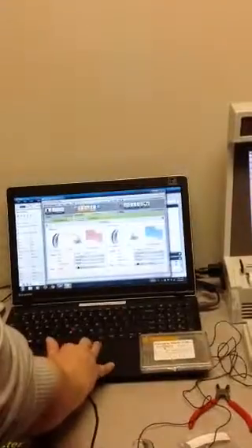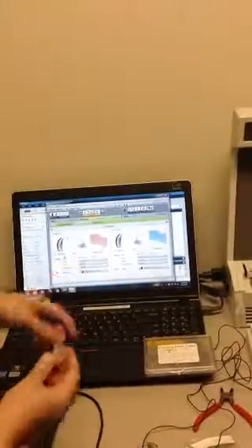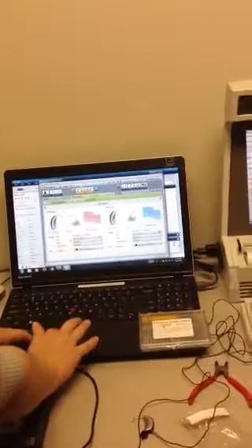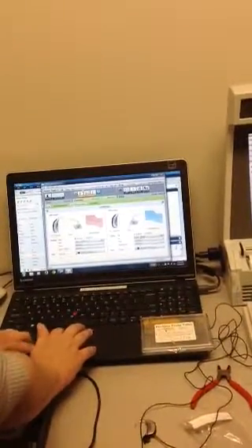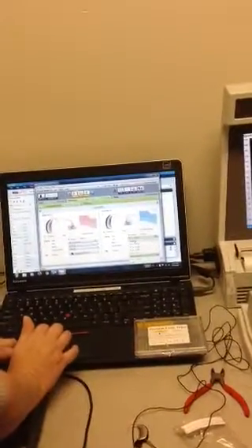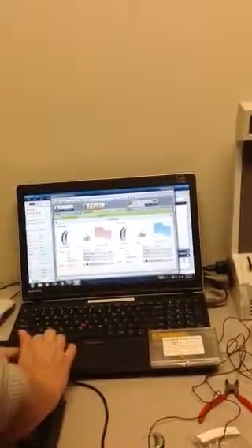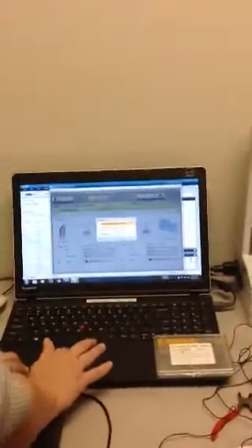Alright, so when I go in, it wants to verify what type of mold and acoustics you have. So her mold is a full shell unvented. The venting is what it's looking for. So it's going to ask me how am I coupling it. I have it coupled with a standard tube. And then the venting, her ear mold's not vented, so I'm going to say that it's occluded. And then it's going to recalculate. So you're going to get these little orange arrows. And then the target here will turn orange, meaning that it wants to reset your settings. So I'm going to do that. It'll recalculate.